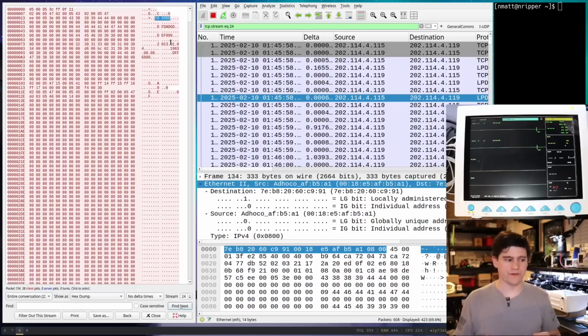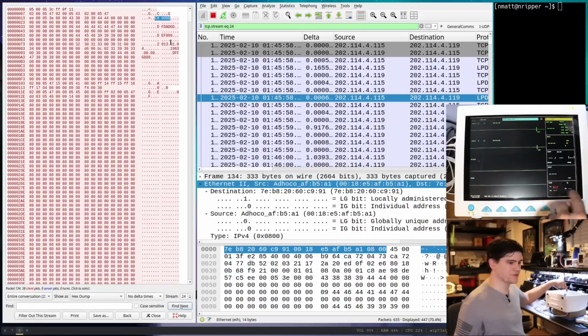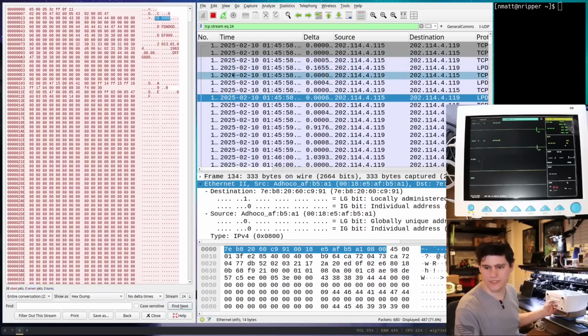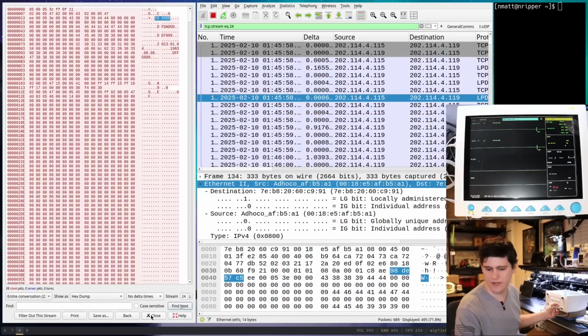I want to go a step further, and I want to find the actual other pieces of data, like this temperature reading down here, and then I have this pulse oxygen thing right here. And so what we're going to do is we're actually going to capture that right now.